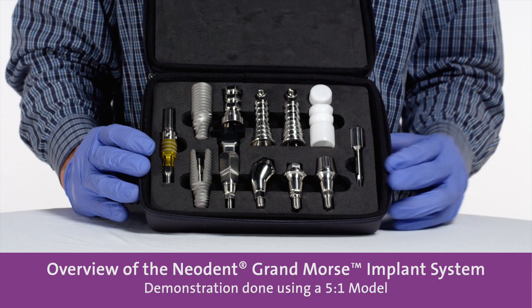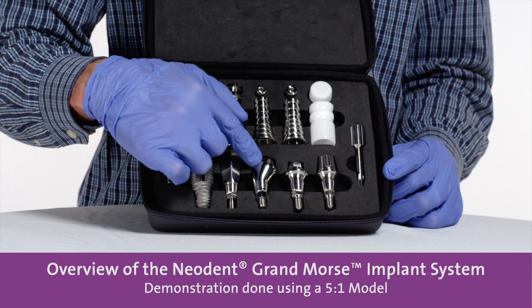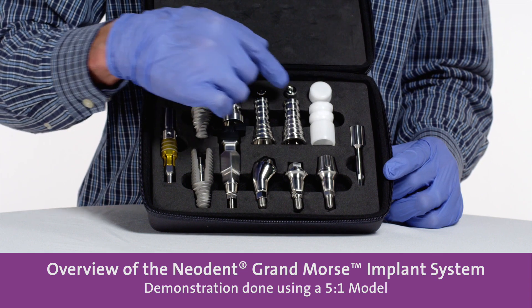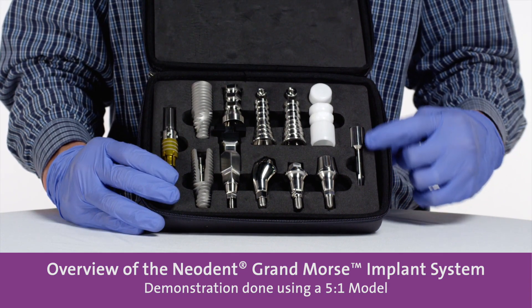And also, all the screws in the abutment or the occlusal screws, we use this same driver. It's called the neo driver. Thank you.